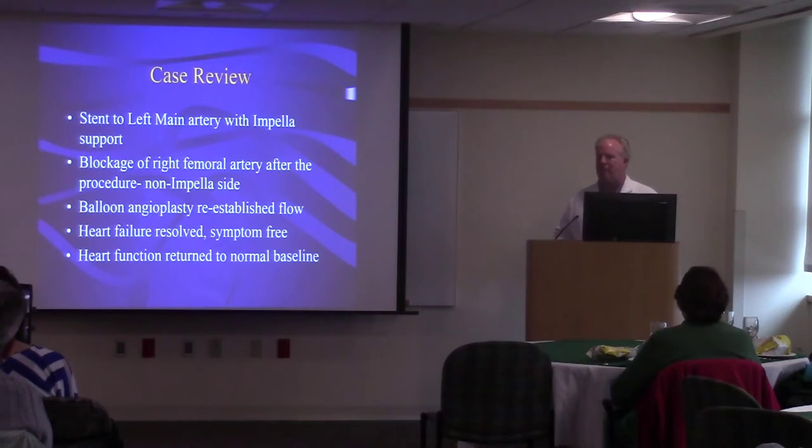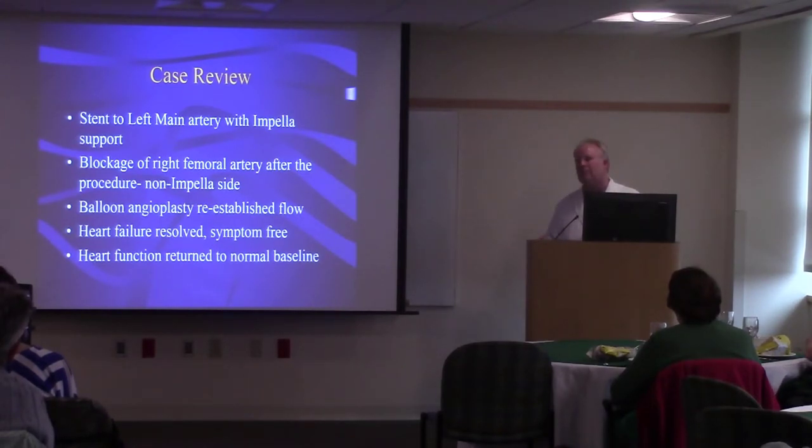So it doesn't stay in long term. I mean, some patients we do leave it in for a couple of days. But those are different kinds. That's not protected PCI, that's a different indication. So if someone comes in with cardiogenic shock, they had a big heart attack, maybe they have contracted a problem that makes their heart crazy, we can leave it in for a couple of days. For this particular procedure that I've been talking about, this is just to assist, it helps us work on the heart and open up the arteries.